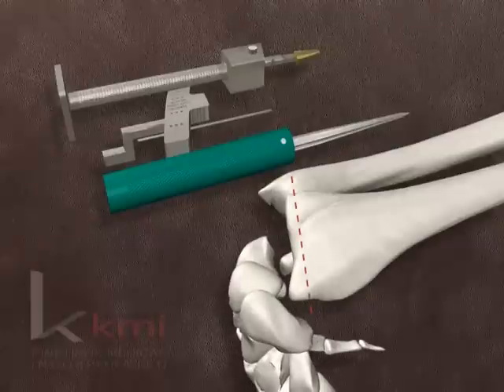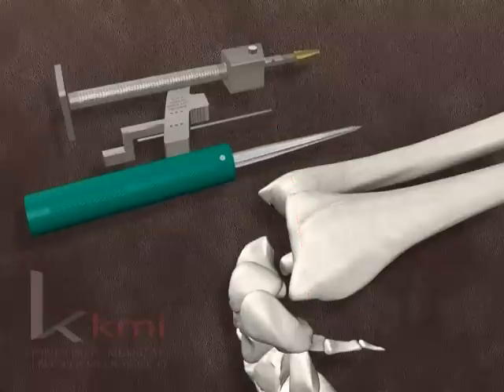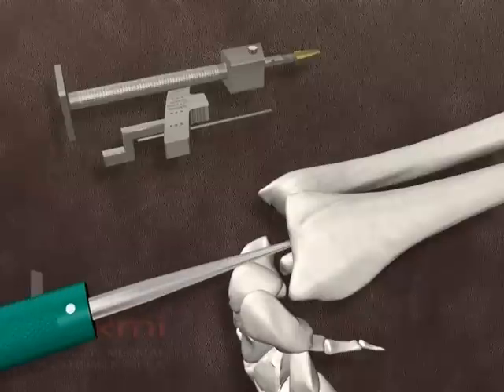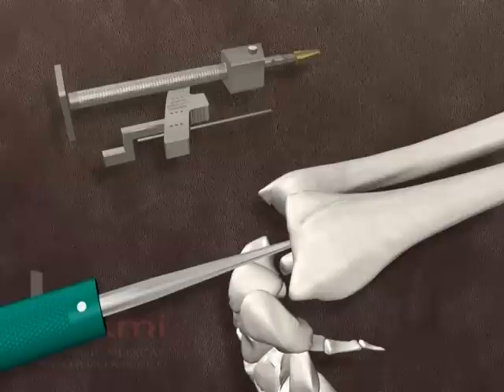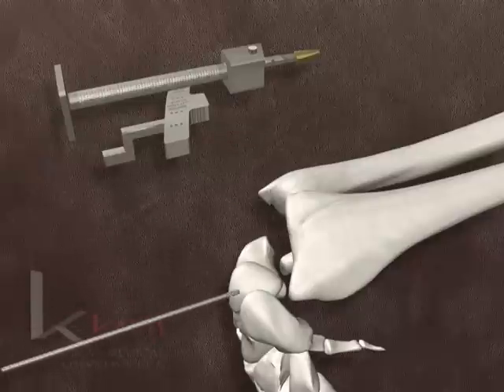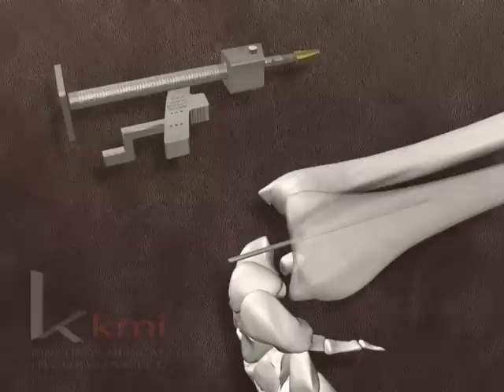A minimal amount of distal radius is resected, removing only the dorsal lip and radial articular surface. Using a bone awl, a hole is made through the articular surface of the radius about 5 mm below its dorsal rim and just radial to Lister's tubercle. The hole is enlarged with a curette. The radial alignment guide rod is inserted in the hole and advanced into the medullary canal. Fluoroscopy may be used to confirm that the guide rod is centered within the canal.